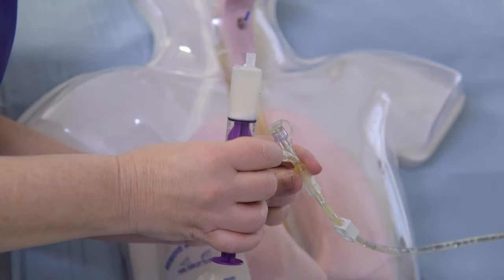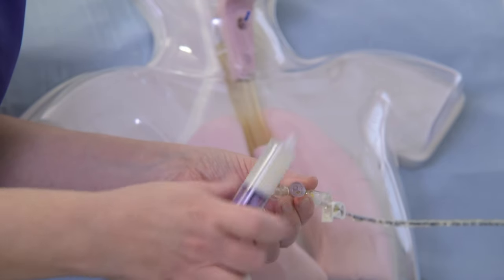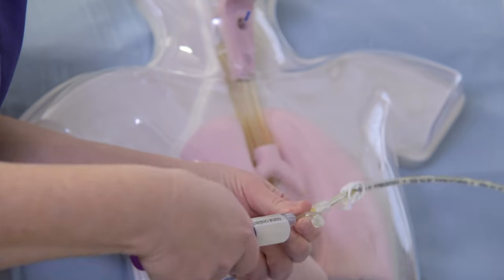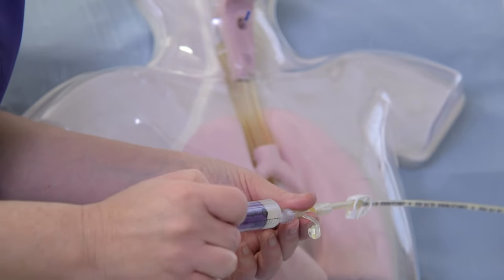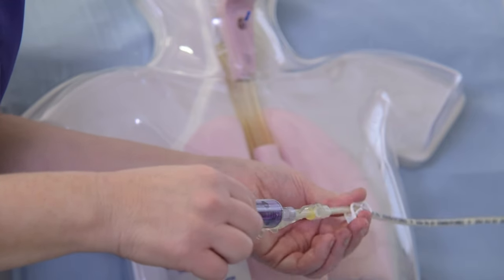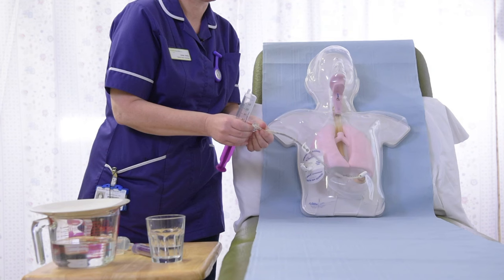Attach the syringe to the Y connector and using a push-pause technique, gently push the plunger until all the medication has been given. Sometimes there may be sediments at the bottom of the glass. Mix thoroughly and add more water if needed. You may also need to gently shake the syringe whilst giving the medication to prevent sediments sitting at the bottom.